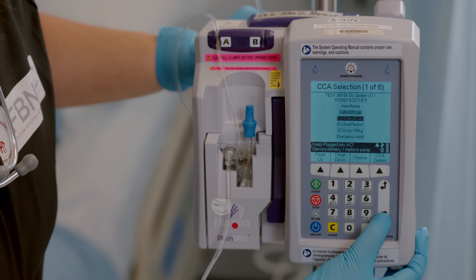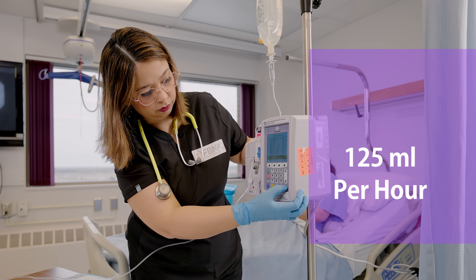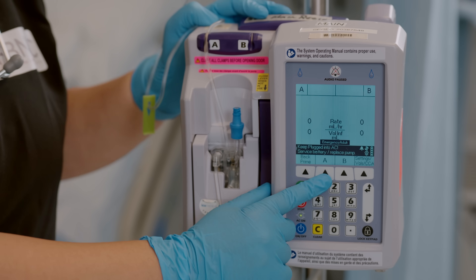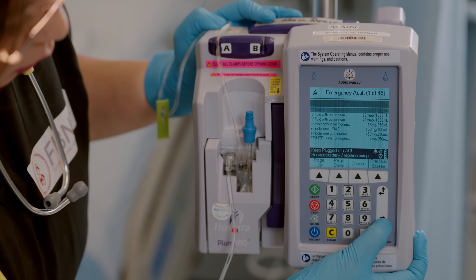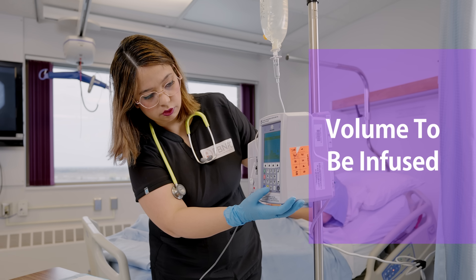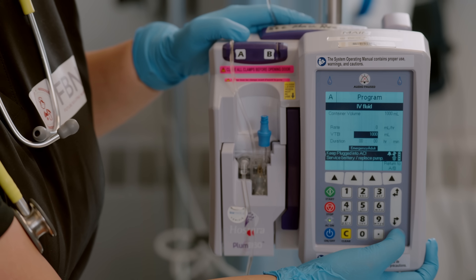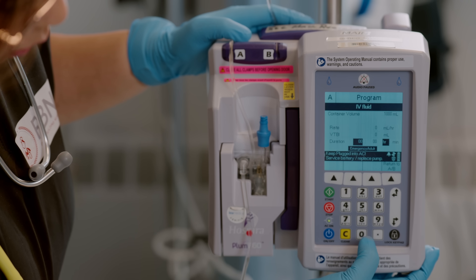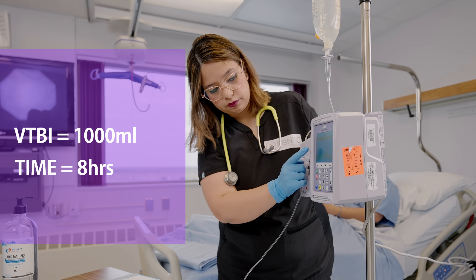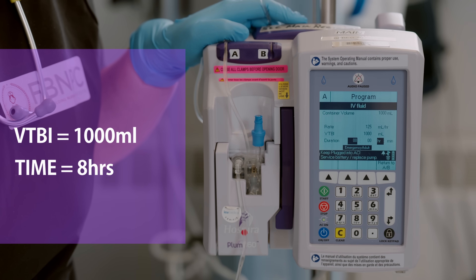From the drug library, choose IV fluids and use the soft keys to set up the rate. For example, if we are giving 125 ml per hour, your IV fluid will be on primary line A — press the soft key underneath line A to select it. As it's a smart pump, insert your VTBI — Volume To Be Infused. Let's say we're giving 1000 ml over 8 hours: VTBI is 1000 ml and time is 8 hours. The pump will automatically calculate and display the rate of 125 ml per hour.